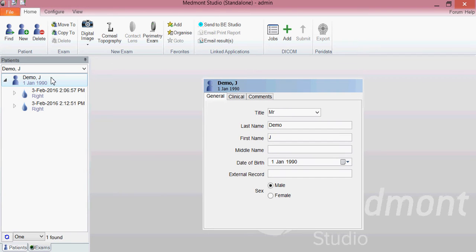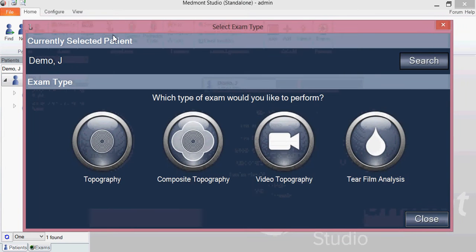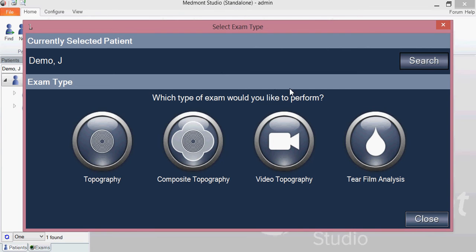Start by selecting the patient you'd like to capture on, then go up to the corneal topography capture icon. This brings up the capture window. We can select the type of capture we'd like to do — in this case, the tear film analysis. Click on that button.